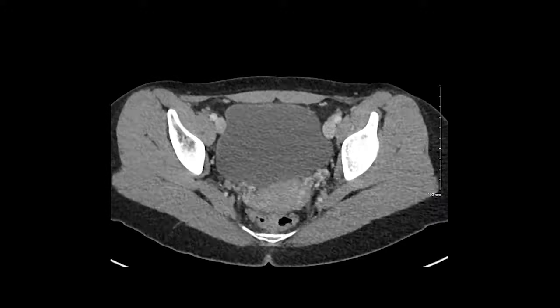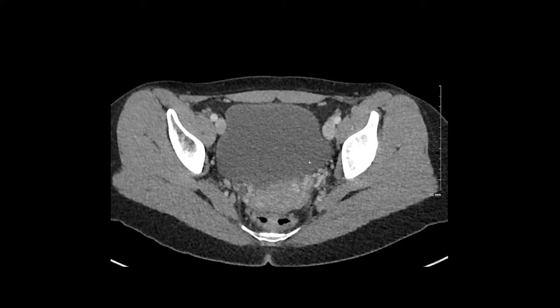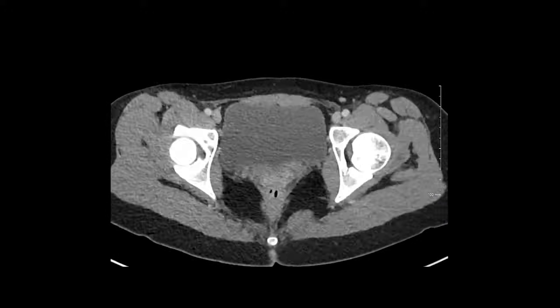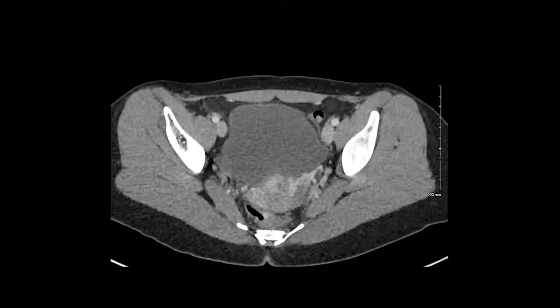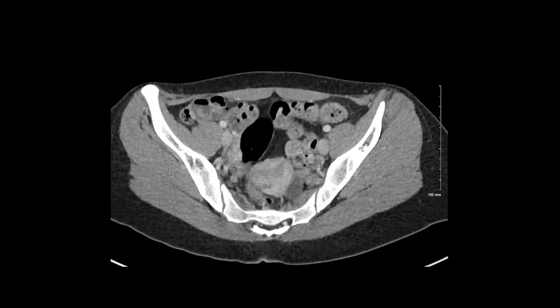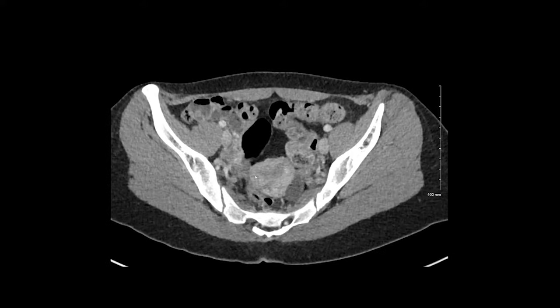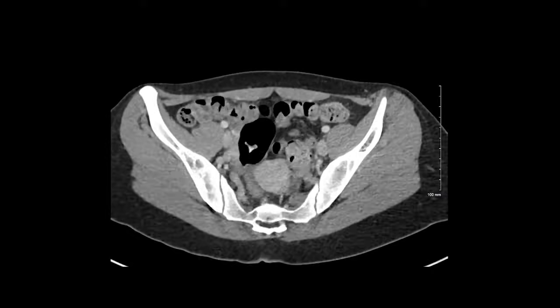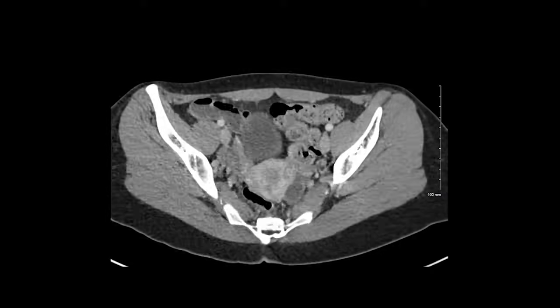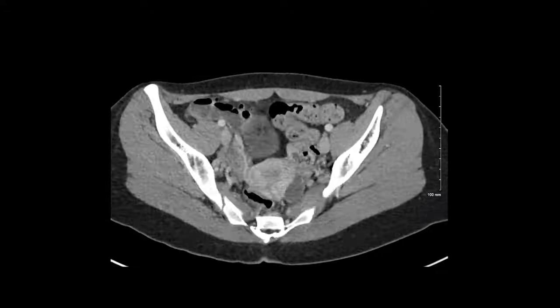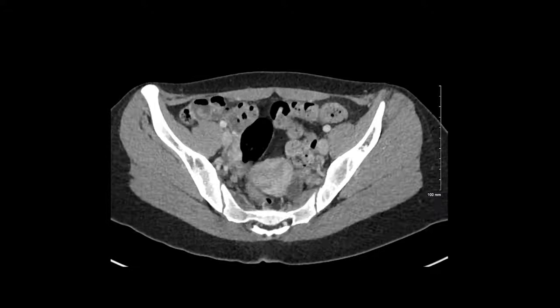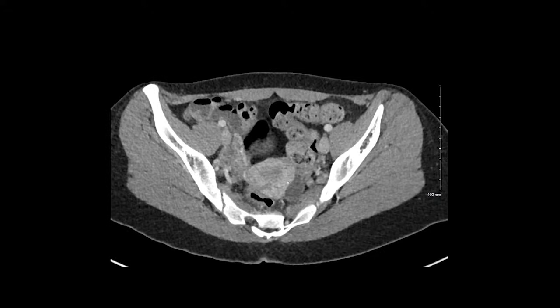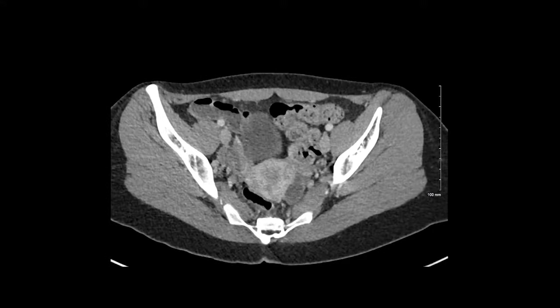After I've looked at the ureters, I'm going to come down and look at the bladder. This person's bladder is relatively distended but is otherwise normal. Next, I'm going to look at the uterus. The uterus has a wide array of normal enhancement patterns. This person's uterus is relatively heterogeneous but likely normal. She has a left ovary sitting here next to the uterus, and the right ovary is actually over here along the pelvic sidewall.